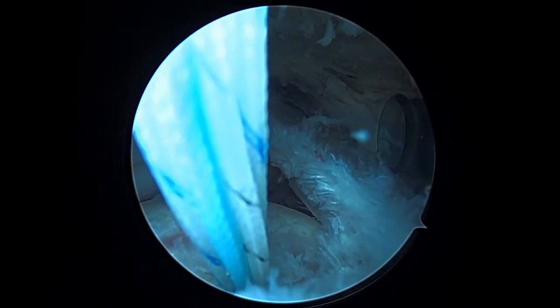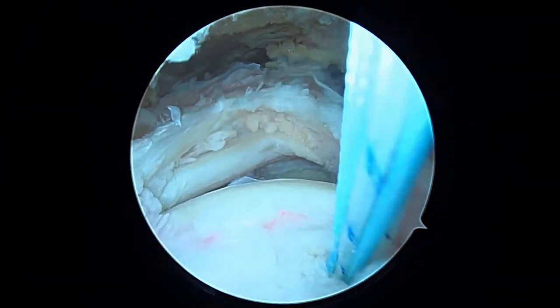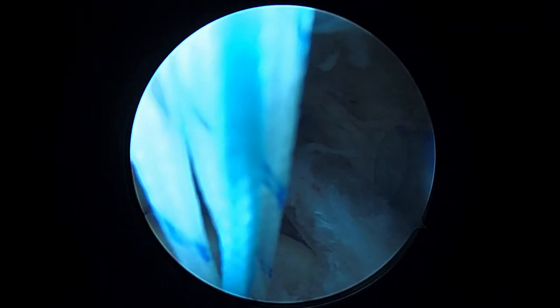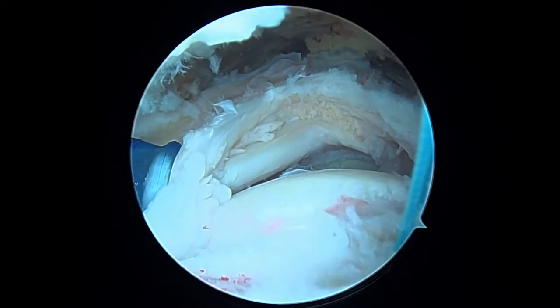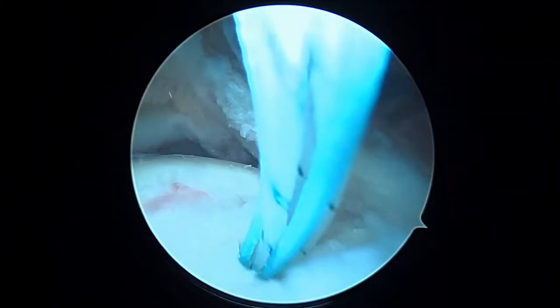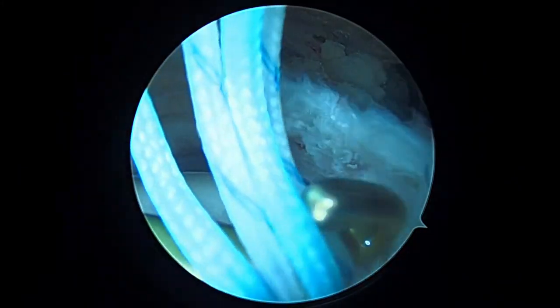Here's our suture anchor down in the bone — it's got three sutures attached to it and it's very solid in the bone. Now we're going to take an instrument called the crochet hook, coming in from the front of your shoulder. We're going to decide what suture to work with first. These black and white sutures are the most posterior, so we'll take this one first.